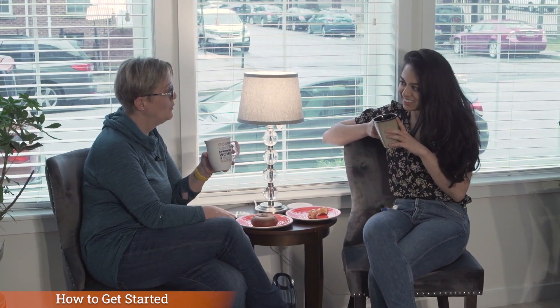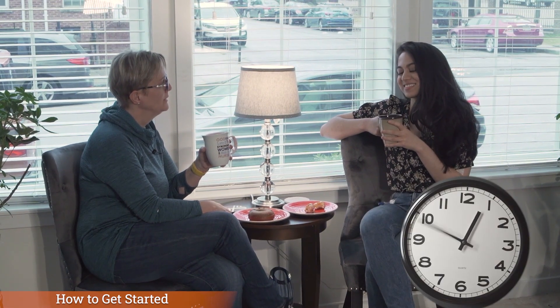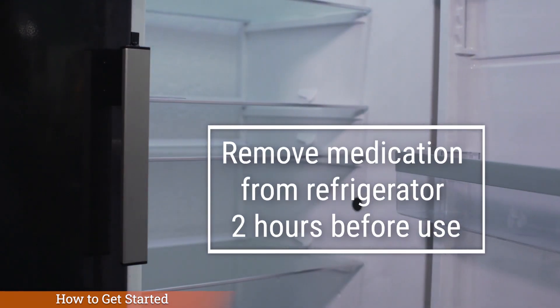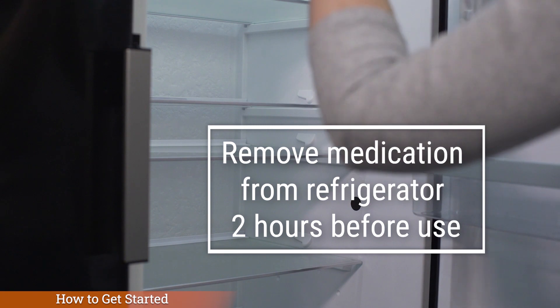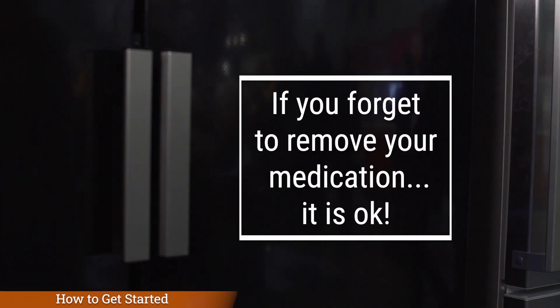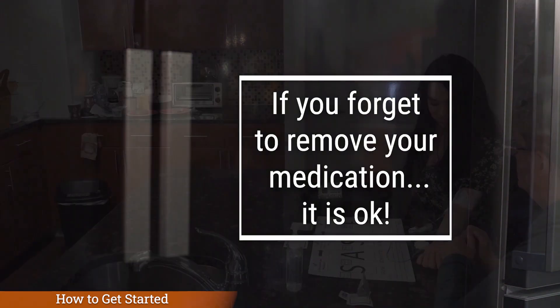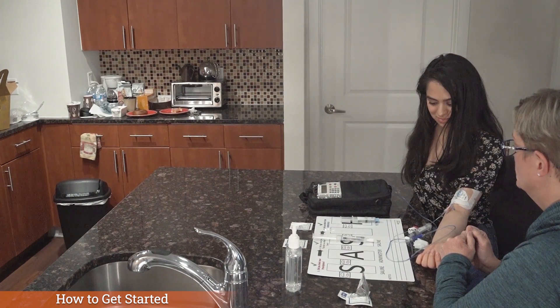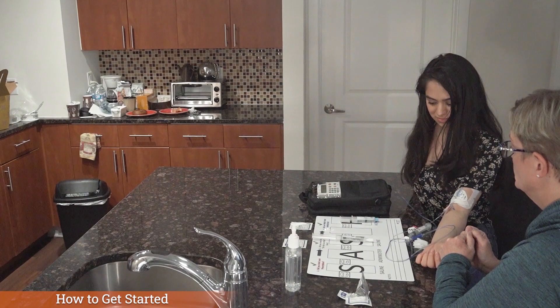How to get started. Your nurse will tell you how to store your infusion medication. This also can be found on your medication label and on your pharmacy prescription. Your nurse will tell you when to take your medication and how often. If your medication is refrigerated, we recommend that you remove your medication from the refrigerator at least two hours before it's time to infuse so that it can get to room temperature. If you forget to remove your medication ahead of time, it's okay. The cold medicine will not hurt you, but the cold fluid may feel a bit uncomfortable while it's infusing and it may take a little bit longer to finish infusing.